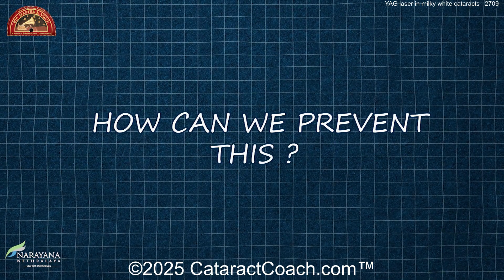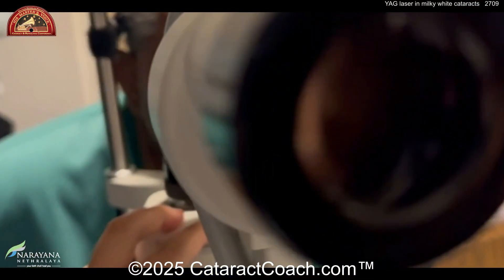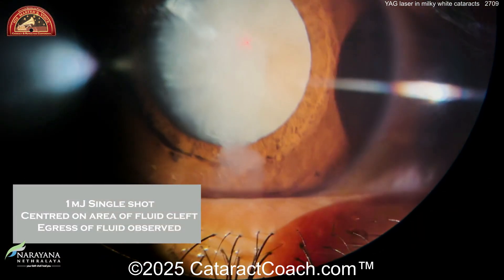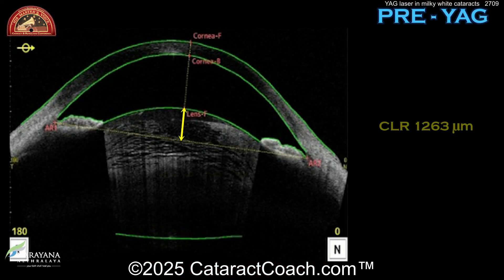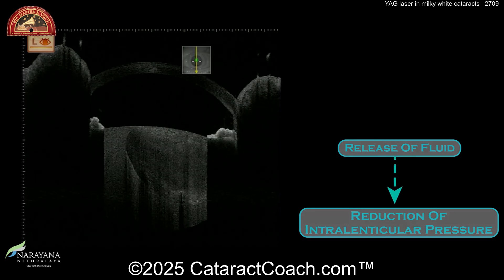How do you prevent this? Use a YAG laser. Here's the patient just prior to surgery. You can use the YAG laser for a single shot — one millijoule right on the central lens capsule. And look at the fluid escaping. You can see pre-YAG how thickened that lens is, and after doing the YAG laser you get a release of fluid coming out of the capsular bag.